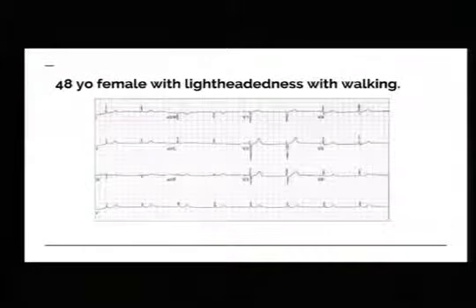Okay, so what is that rhythm? Yep. So that's why she's lightheaded. She's in a junctional rhythm, and she's slow. So, did she have an event that took out her SA node? That's what our job is to work up and figure out. But you at least know this is not a patient you would send on her way and release because she's feeling better once she sits down.